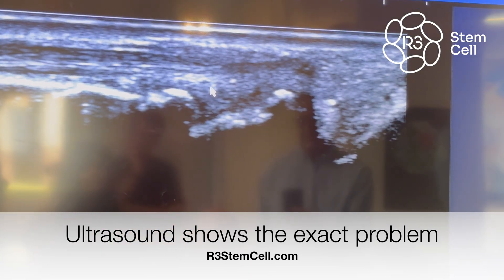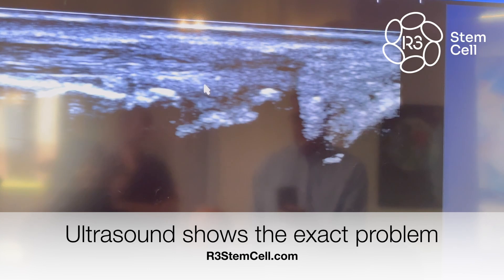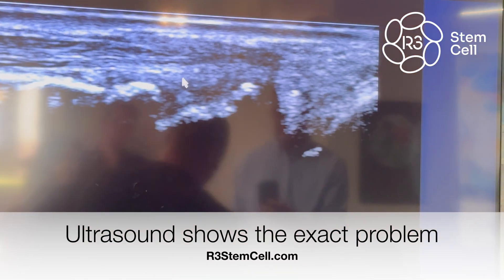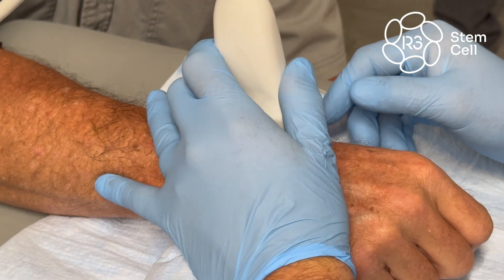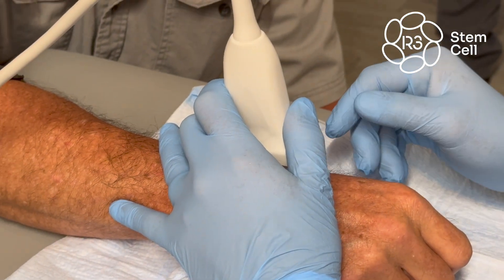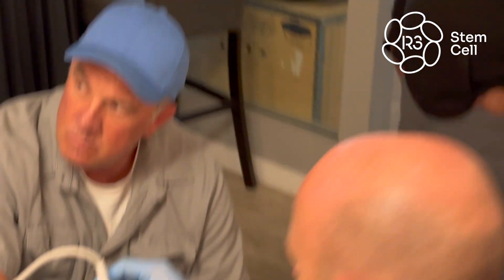I'm going to suggest you get a little bit more of your hand down — get super settled — because this is a very small, finite injection. The more access points you have down, the more controlled you're going to feel.